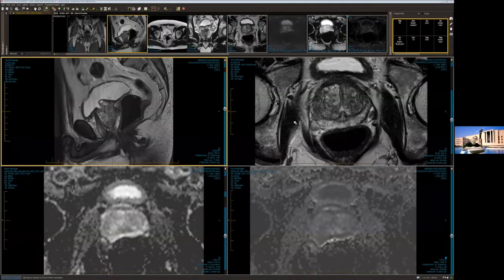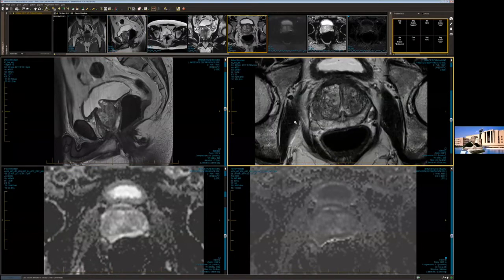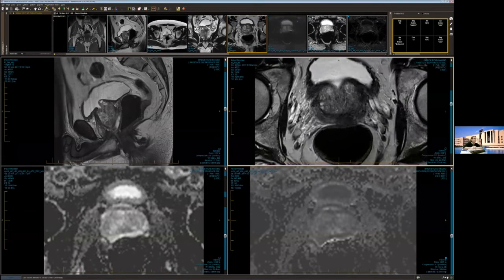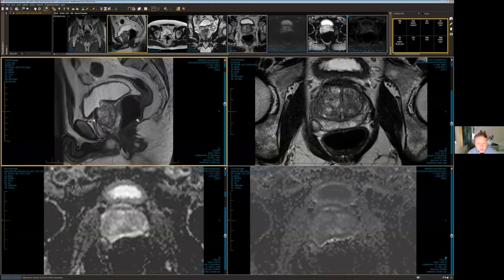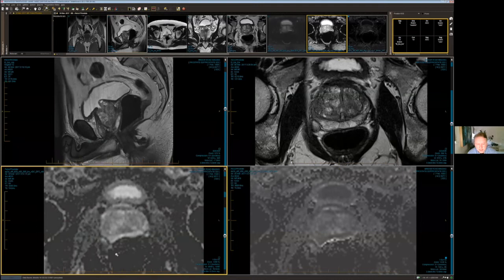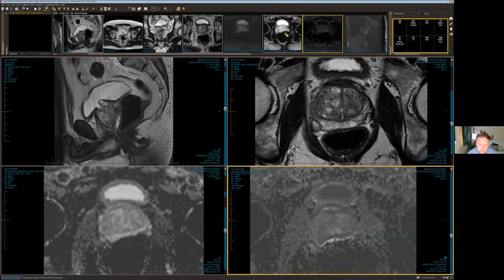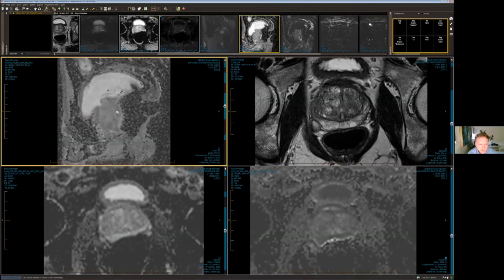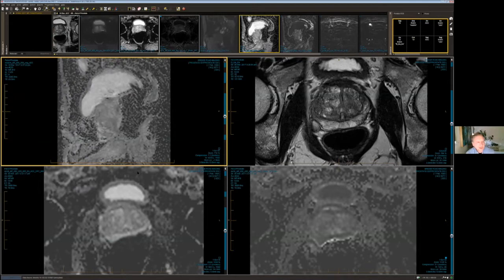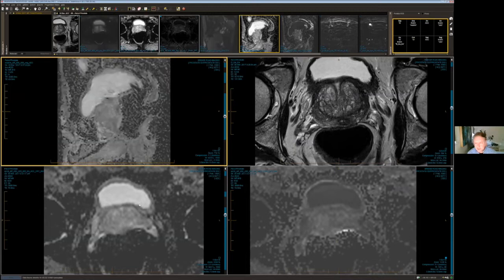I have a question for the pathologist. Yes, is there the typical pattern, cribriform pattern? That's a good question. I haven't gone back and reviewed, but certainly at 4+5, I'm expecting to see, well, actually, I can't answer your question about whether there's cribriform. I'd have to review the actual slides, but certainly high grade and not what was expected. I do know where you're getting to, whether or not we're not seeing it because of the pattern of the actual prostate cancer.